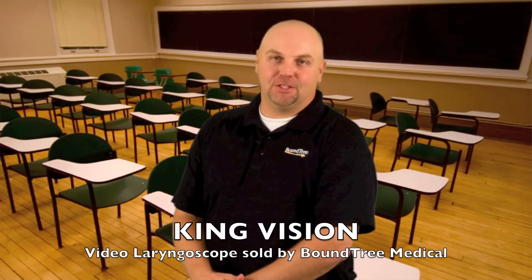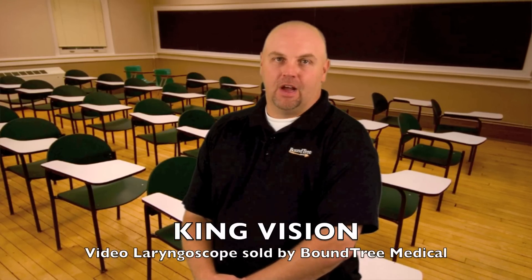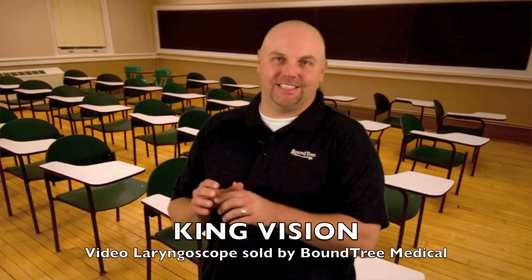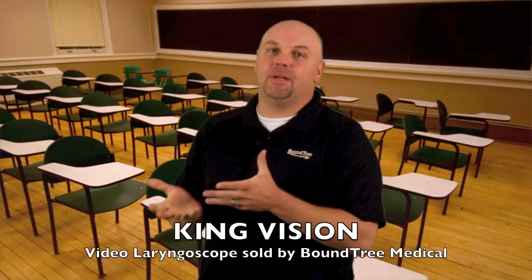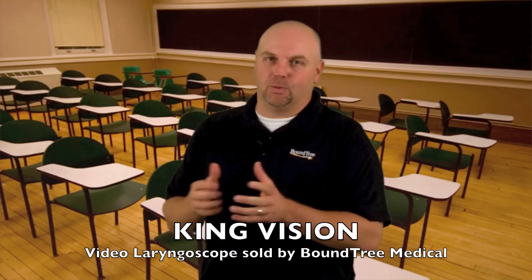Today I want to show you a quick demonstration of the King Vision Video Laryngoscope. I will do a quick intubation on this mannequin without putting it into the sniff position, thus making the intubation as difficult as possible. I will then do the same intubation a bit slower so that I can point out a couple of things as we go along.